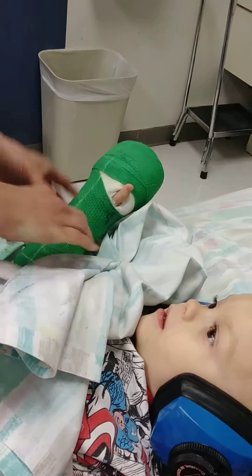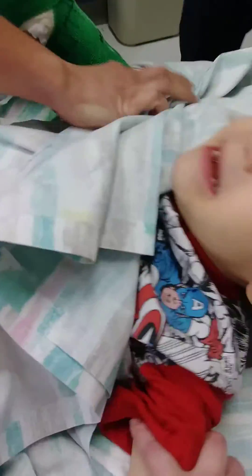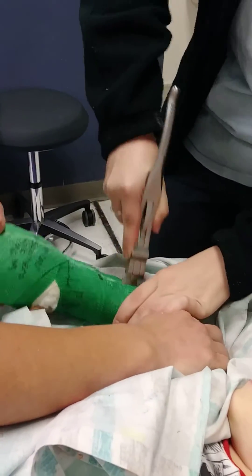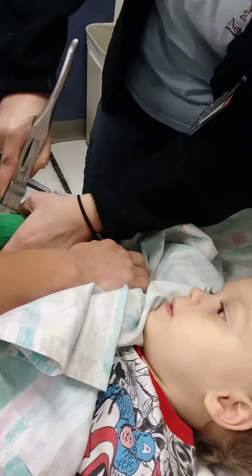You want to hear it? You want to take them off? Here you go, you can take them off. That's it! Hold on, lay down, we're going to find your arm. Where's your arm? I'm gonna find it.